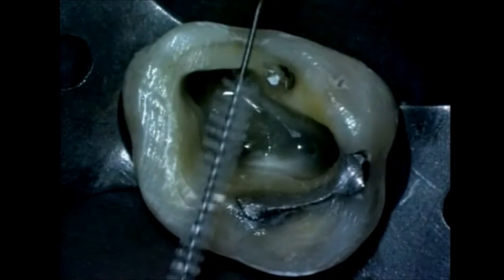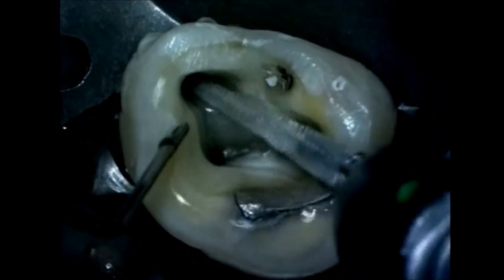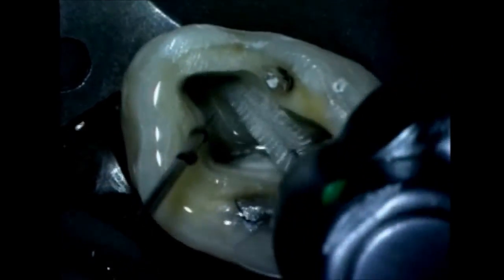A 17% solution of EDTA is flooded into the tooth, and we use a rotary brush to activate this solution. The bristles collapse into the irregularities of the canal and more effectively remove the smear layer so we can get a tighter pack during three-dimensional obturation.